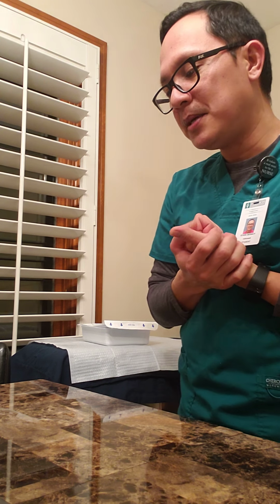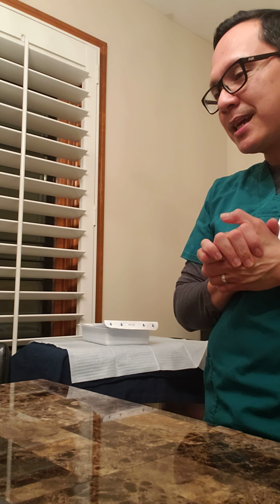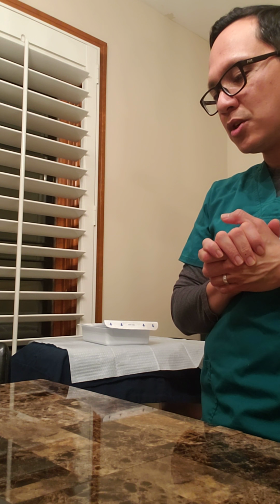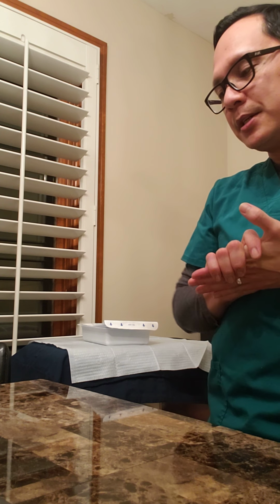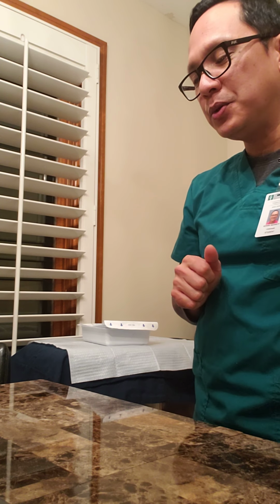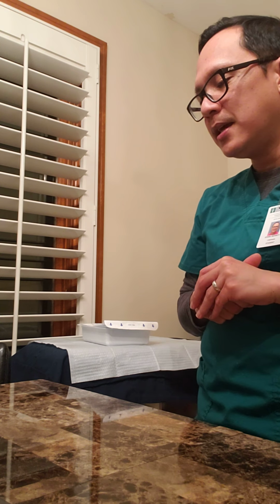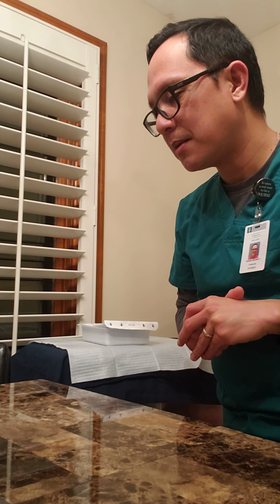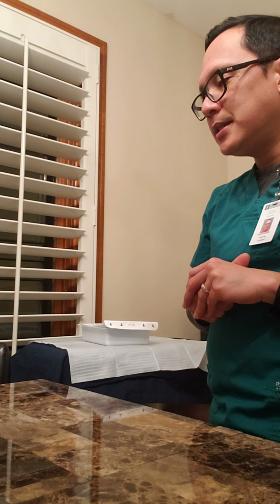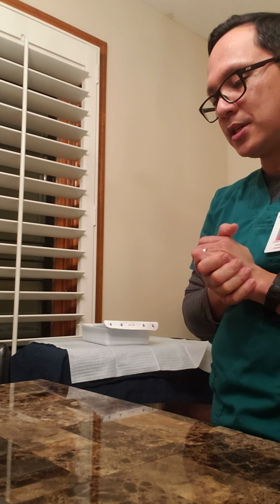Okay, today we're going to be doing a dressing change on your central line. Is that going to be okay? I know it's been a couple of days since the last dressing change, so I want to make sure we keep it clean and good. When we do the dressing change later, I'm going to ask you to turn your head to the other side, away from the dressing, just to make sure we don't run the risk of having any respiratory contamination on the line, okay? All right, thank you very much.